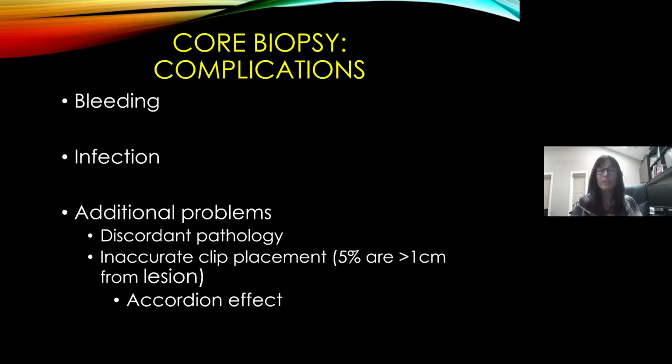The likelihood of infection after a core biopsy is very low. These are not sterile procedures. However, we do clean the skin off, and everything we put inside the breast is sterile. As long as you know what you can and cannot touch, the likelihood of contaminating a patient is very low. And in my practice, I've known of maybe 1 or 2 infections that have come back to me. There may be others, but I know it is uncommon.